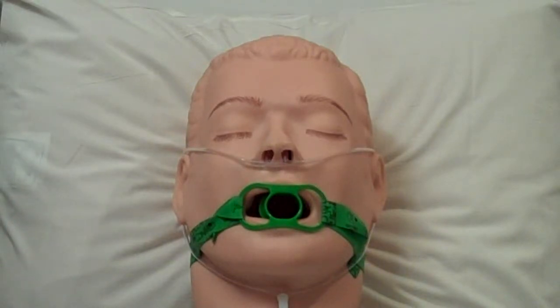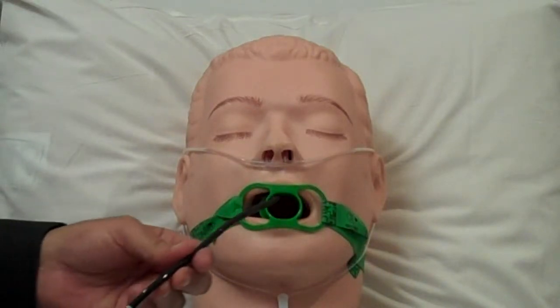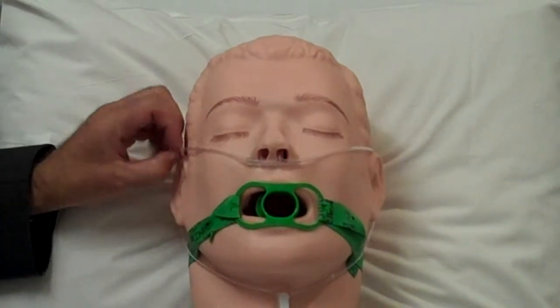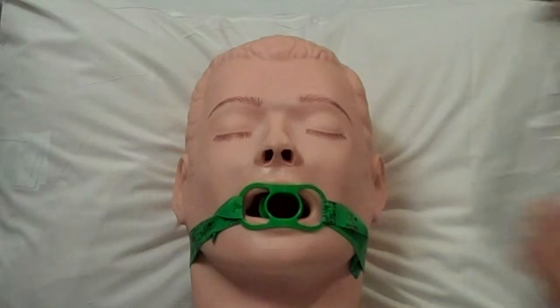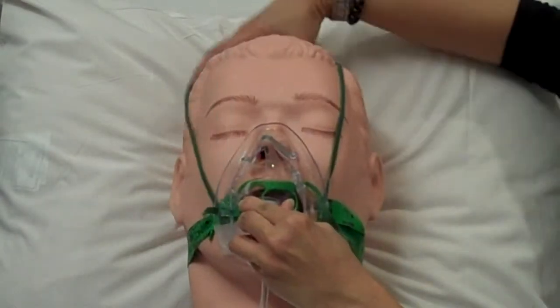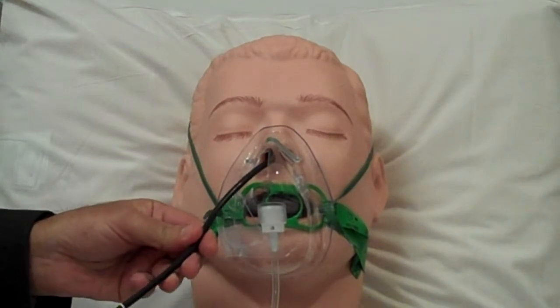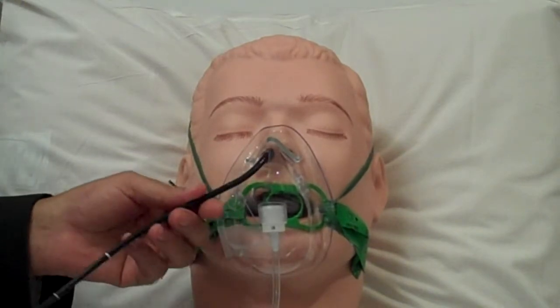We always give oxygen when we do bronchoscopy. When the bronchoscope is inserted through the mouth, the oxygen is provided using nasal cannula. On the other hand, when bronchoscopy is performed through the nostrils, a face mask is applied and the bronchoscope is inserted through the mask into the nostril.